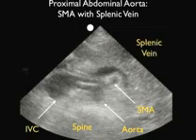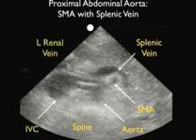right there with its bright or hyperechoic rim, the splenic vein arching on top of the SMA, and the left renal vein we can see coursing just below the SMA. Notice we actually catch the right renal artery coming off the aorta and coursing over towards the IVC.